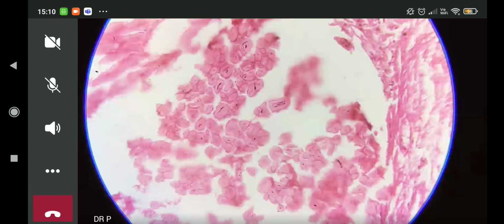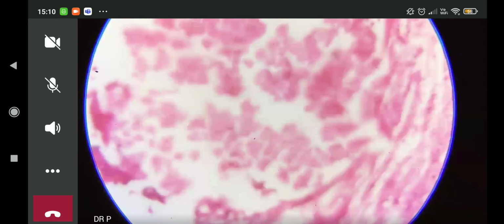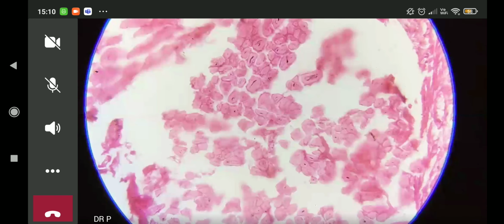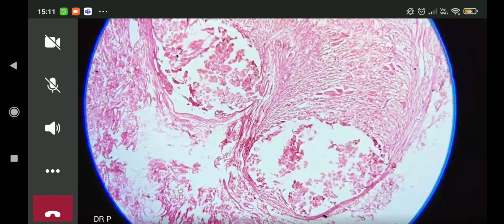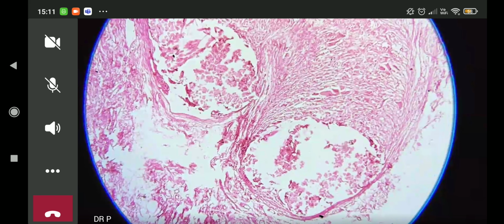So what is coming from the outside world over here? This is nothing but suture material. So this lady most likely had undergone some kind of operation of the genitourinary tract. She might have undergone a ligation, to prevent further conception. Sometimes when you're performing a surgery, you use sutures to close the surgery.